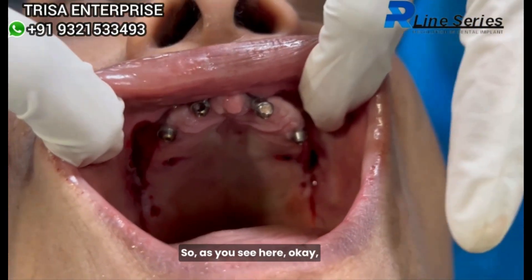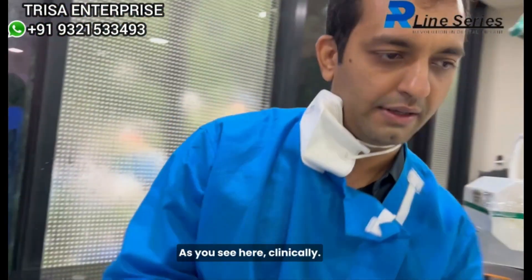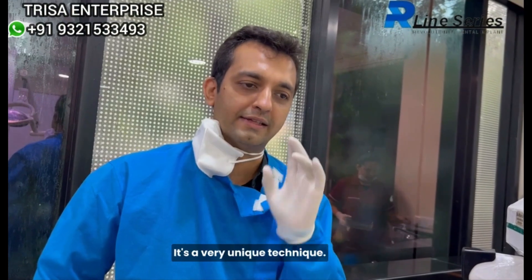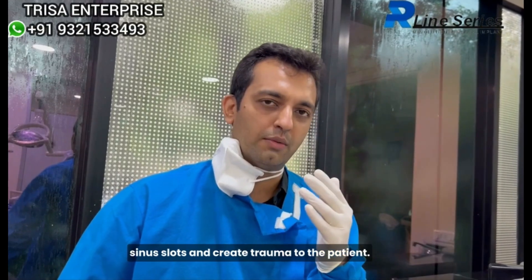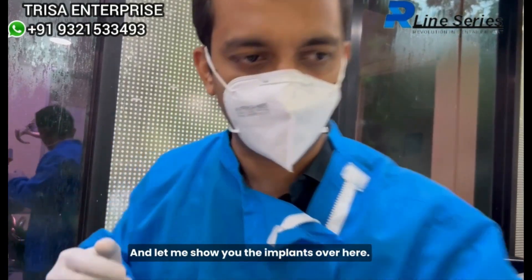As you see here clinically, in this case the zygomatic implants were placed with the two-hole technique. It's a very unique technique — no need to create those big slots, extra sinus slots, or create trauma to the patient. We just create two holes at specific locations to track our zygomatic implants.